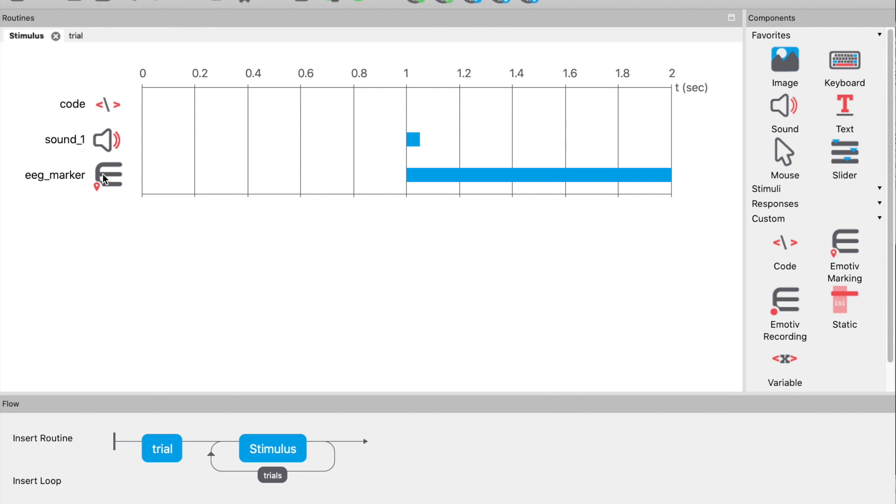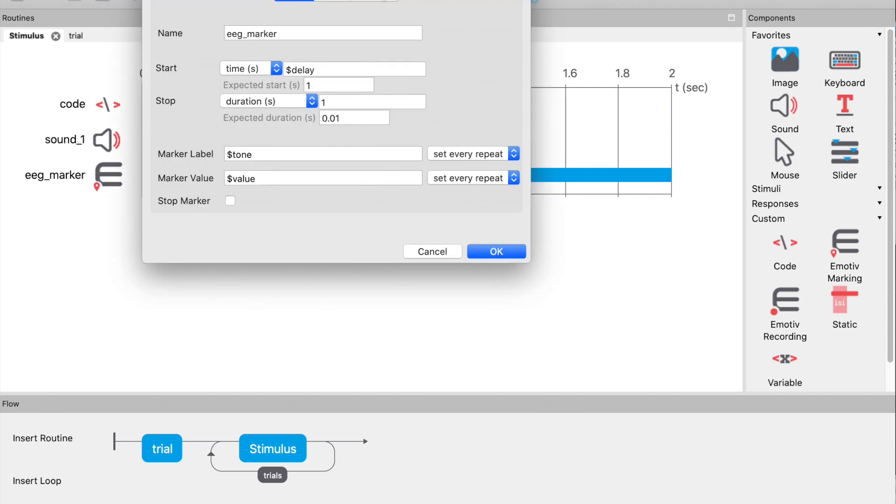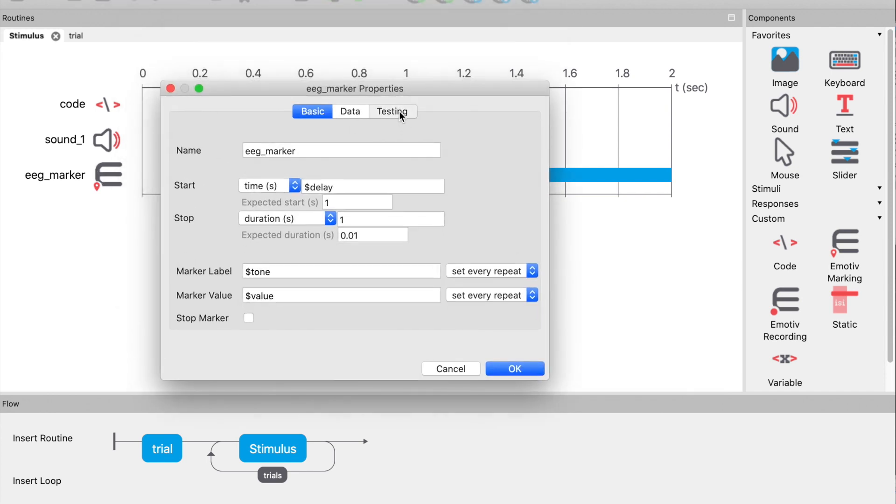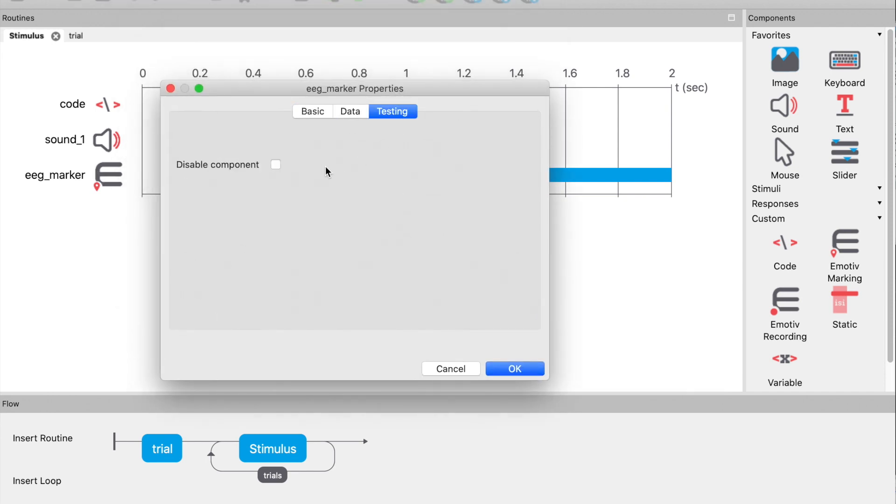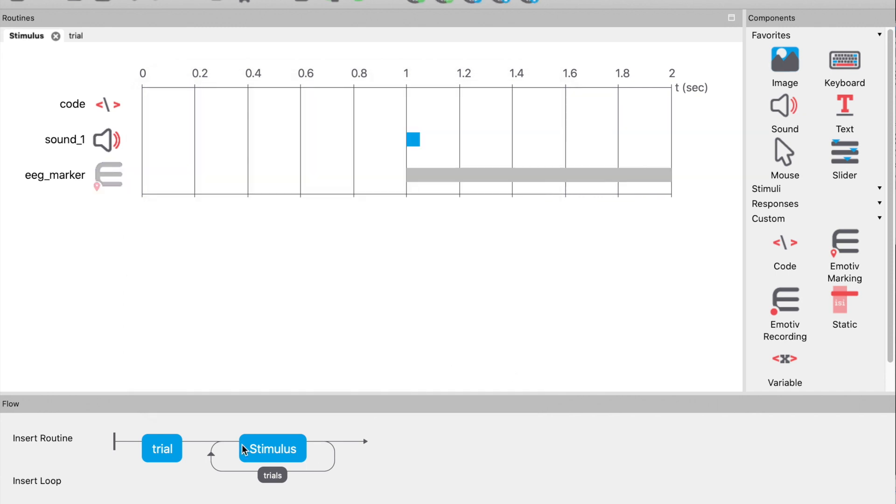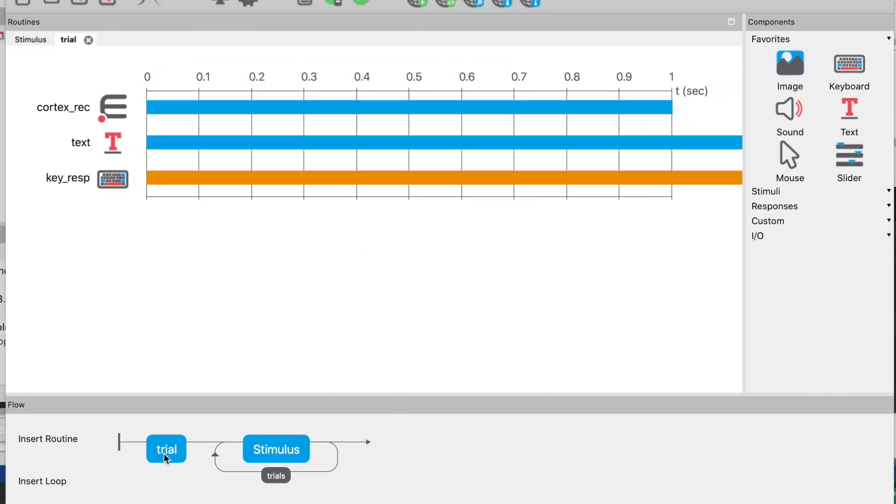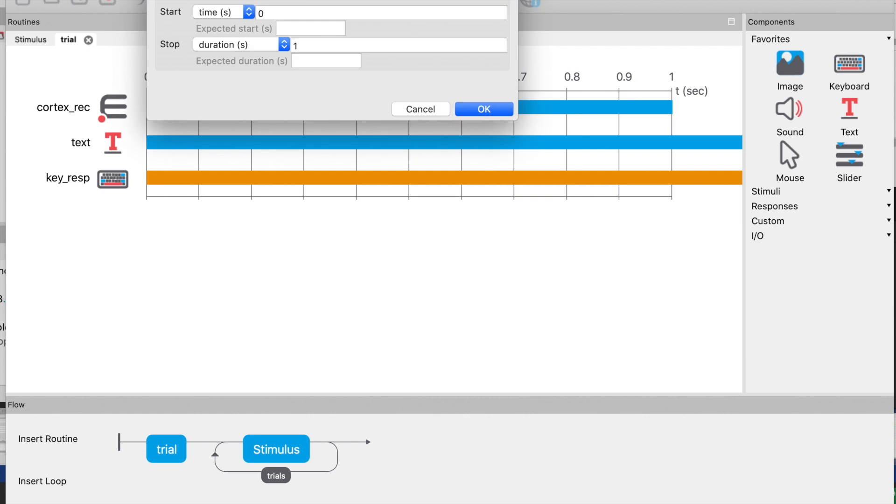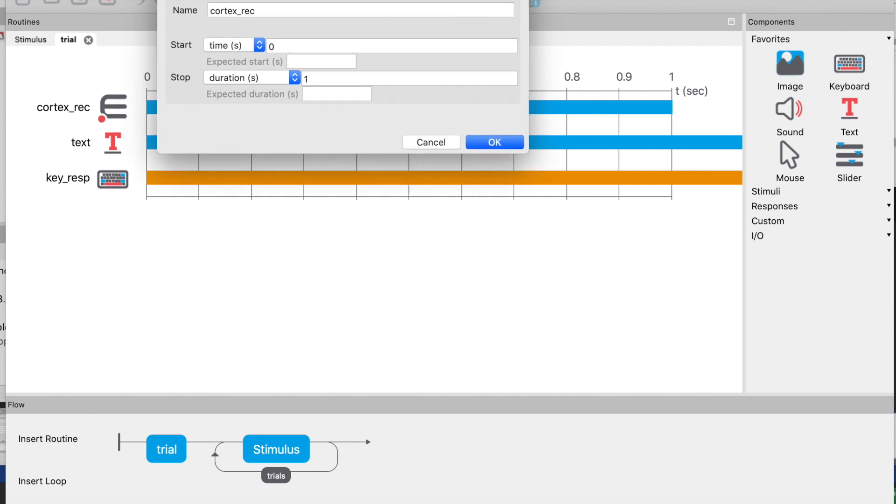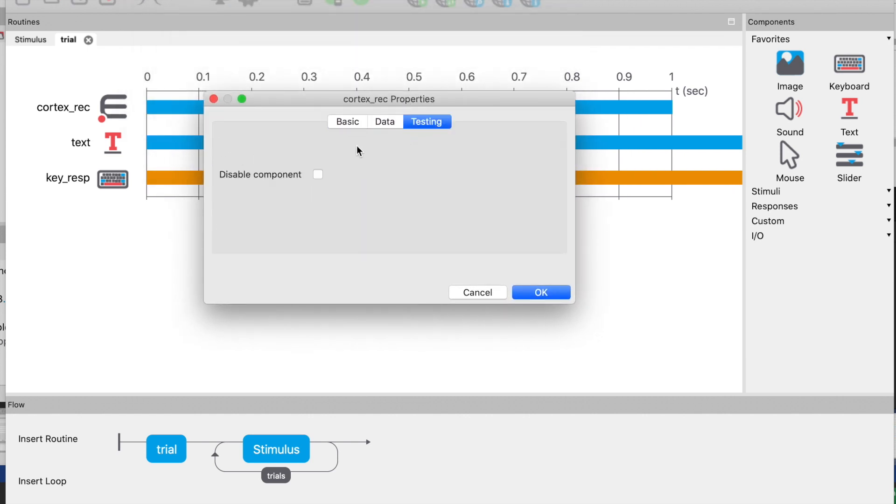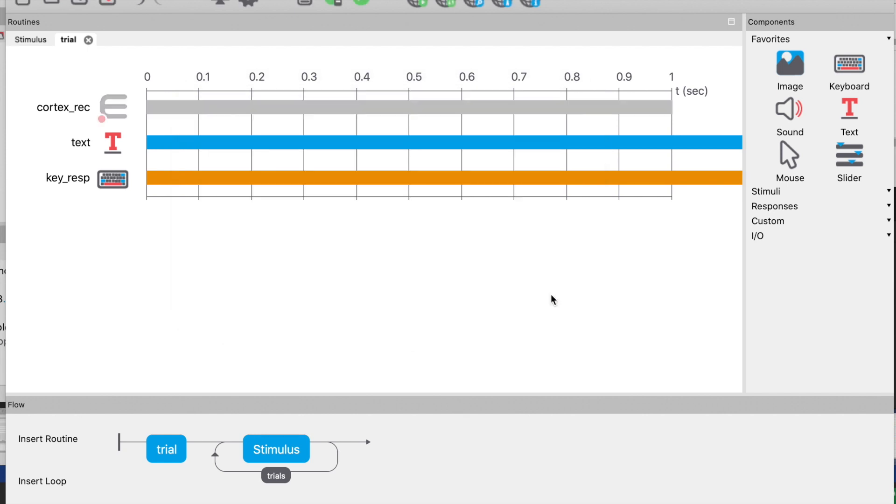Before we collect data, let's check that the experiment is running as we expect. To do this, it is handy to deactivate the EMOTIV components because they don't like it if there is no headset connected. We just open the component, select the testing tab, and check the disabled component. And we do that for both EMOTIV components.